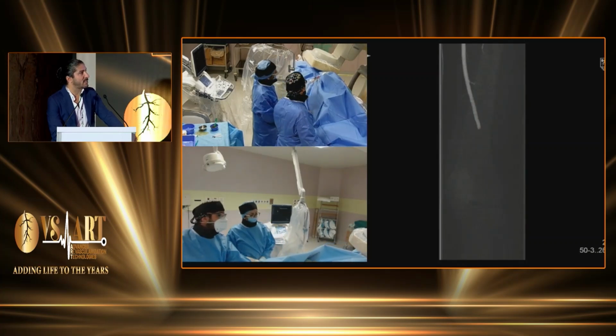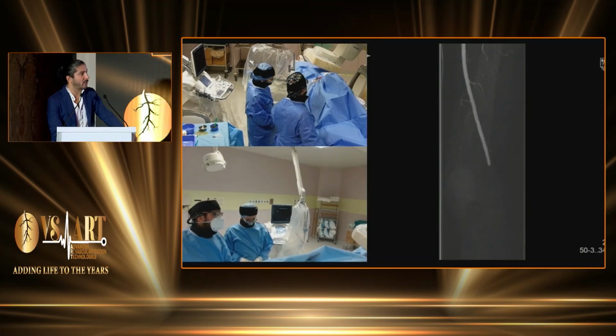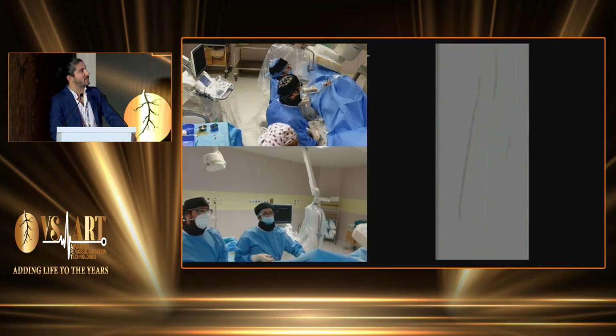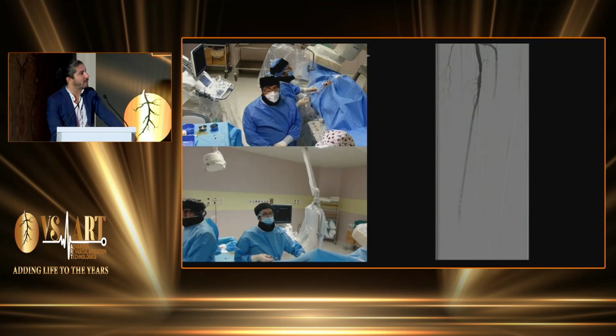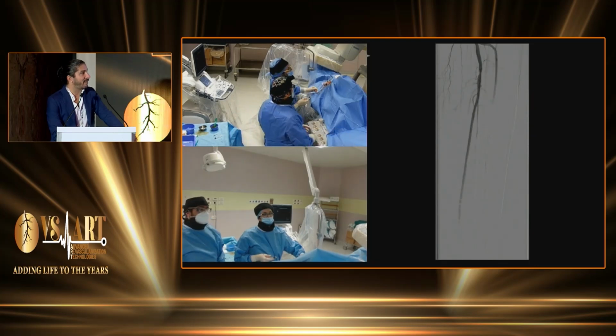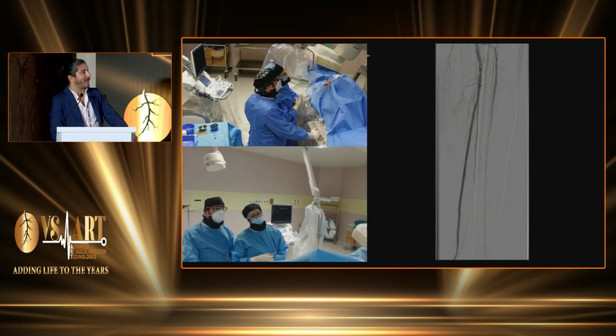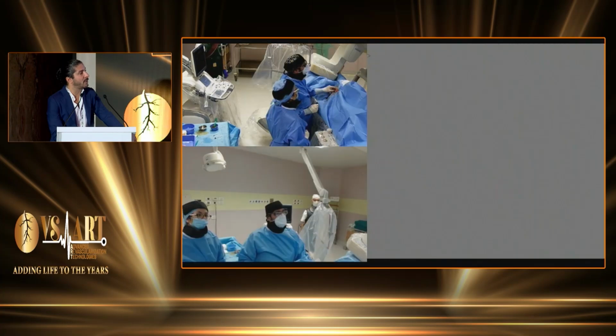It was, as I said, a pure below the knee and below the ankle case with calcified arteries and with some issues to be treated. This is the below the knee segment. You can see the anterior tibial occluded at the medium part of the leg, peroneal very thin, posterior tibial with the stenosis in the TP trunk, and patent posterior tibial. So the patient was with this type of foot lesions.